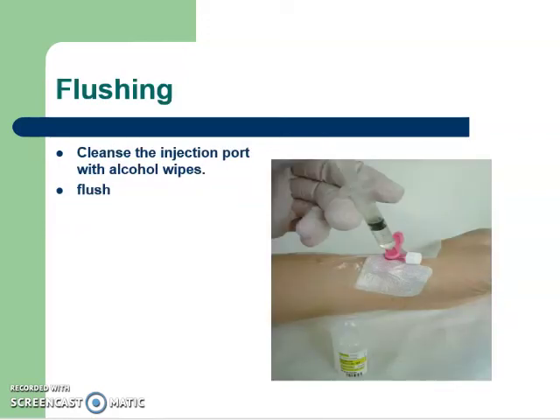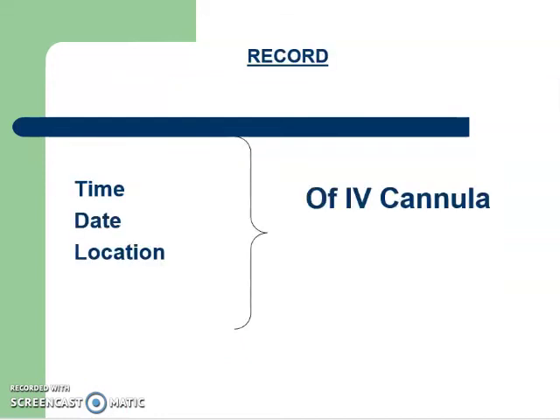Now, this picture is showing the flushing of the cannula with the saline. If you don't flush, the cannula will get blocked. Now, it's very important to put the time and date of the cannula, especially on the sticking plaster.